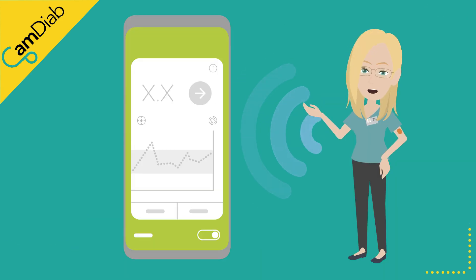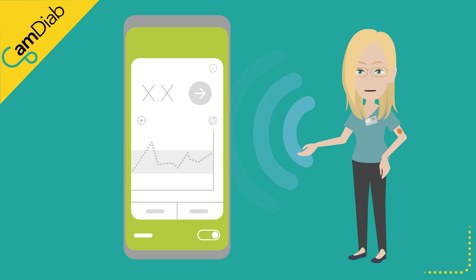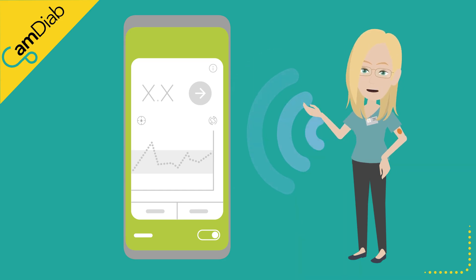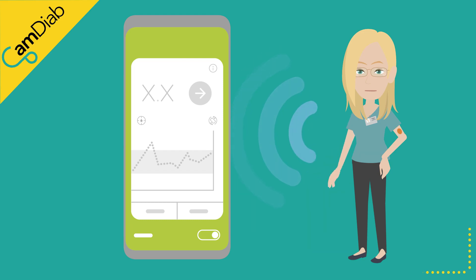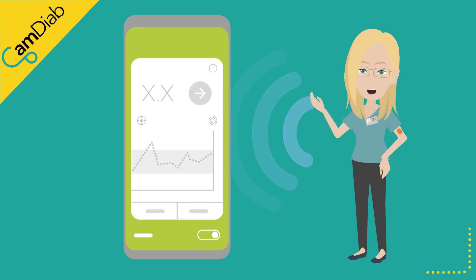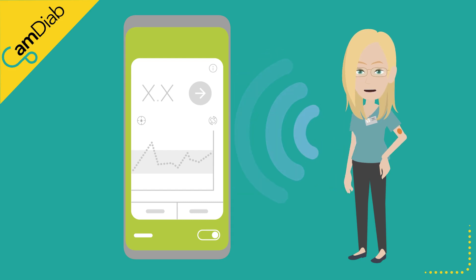The MyLifeCam APS-FX app is compatible with the Dexcom G6 continuous glucose monitoring or CGM sensors. These sensors continually measure glucose in the tissues of the body. Every five minutes, glucose readings are sent via Bluetooth to the app.